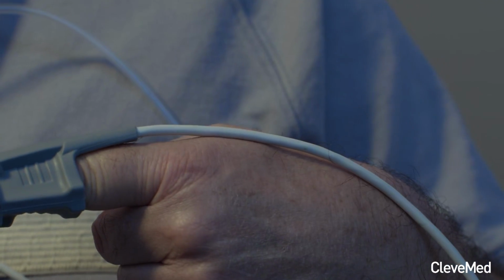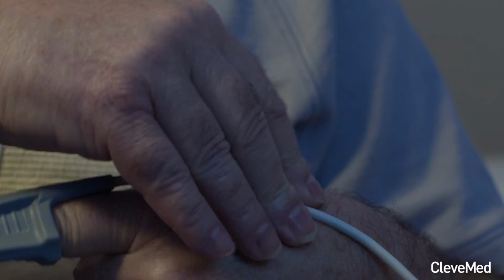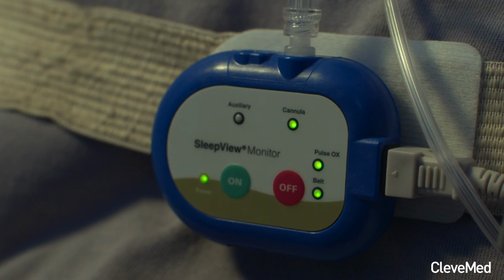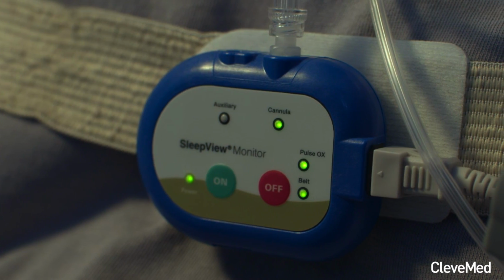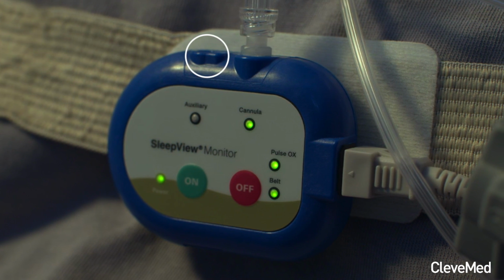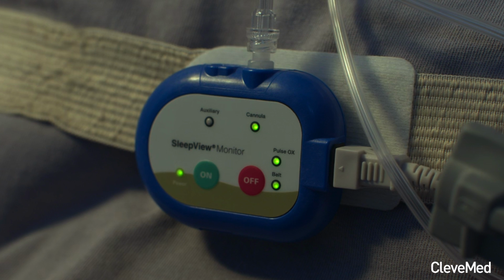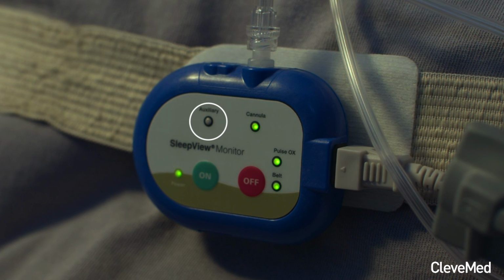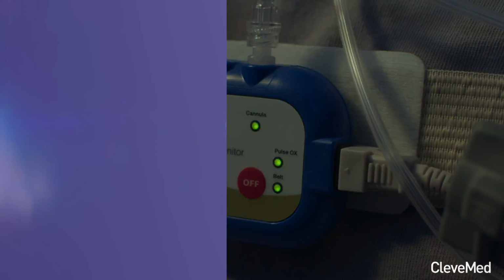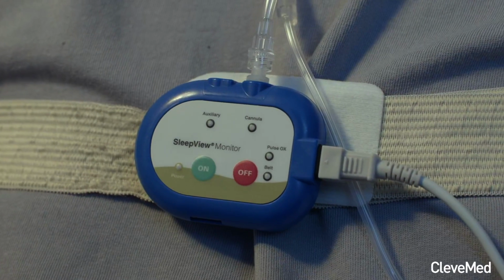Make a fist and then place an adhesive strip across the back of your hand to secure the wire in place. If an auxiliary sensor is sent with the kit, please attach it to the auxiliary port and refer to your patient instruction sheet. You will note that the auxiliary sensor light may remain off if you were not provided with an auxiliary sensor. Now we can start the test.